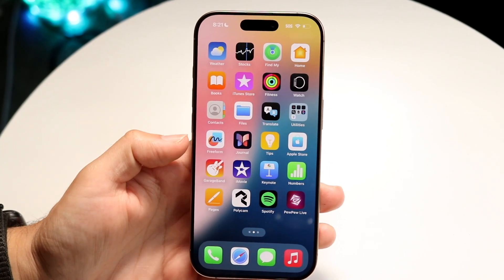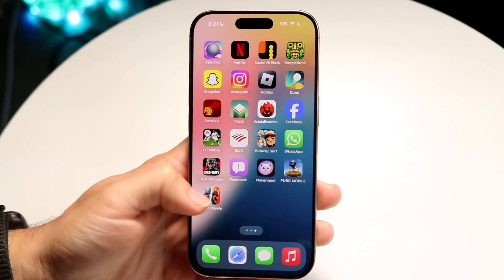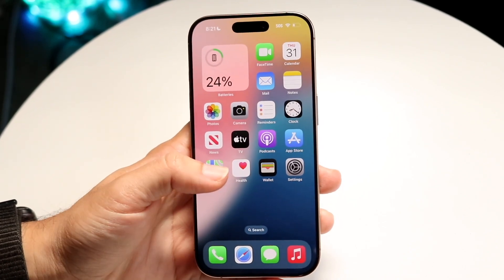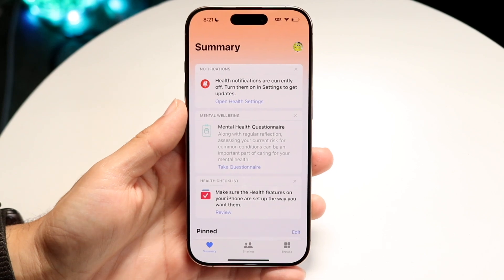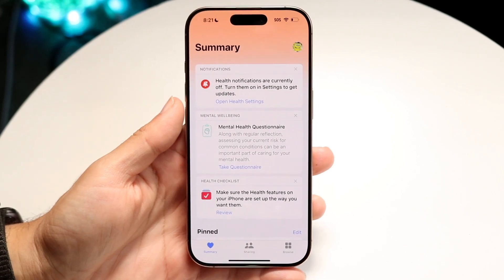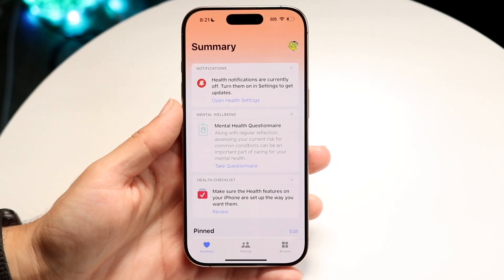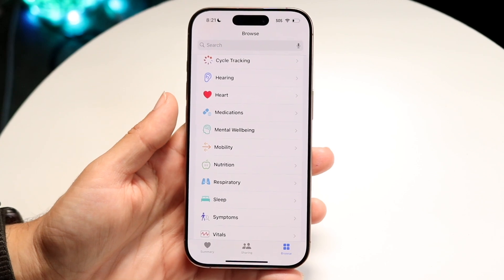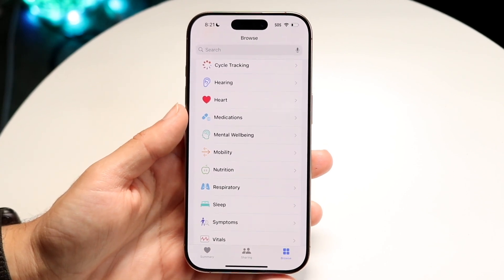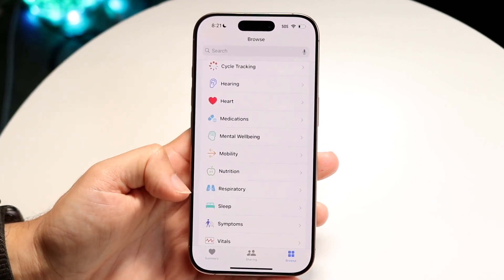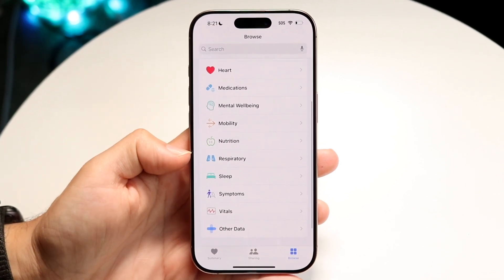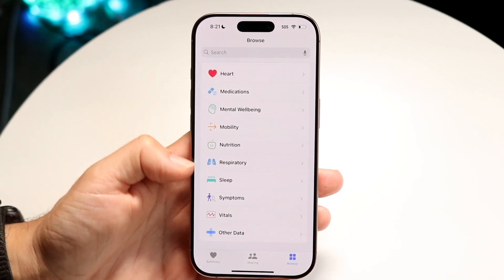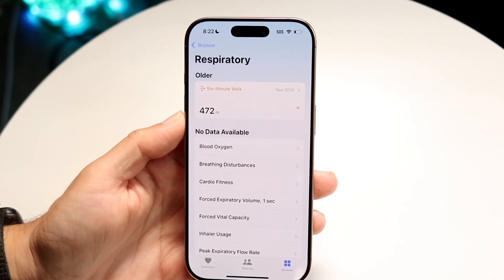Next, make your way over to your Health app. Open it up and you'll land on the main page. Tap on Browse, and then tap on the Respiratory option that appears on that page.